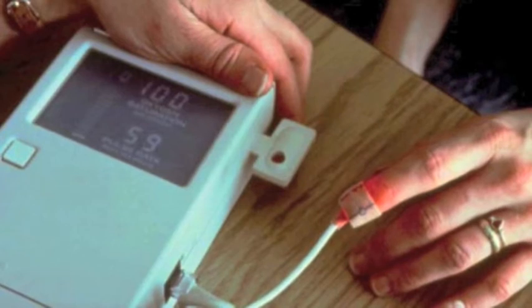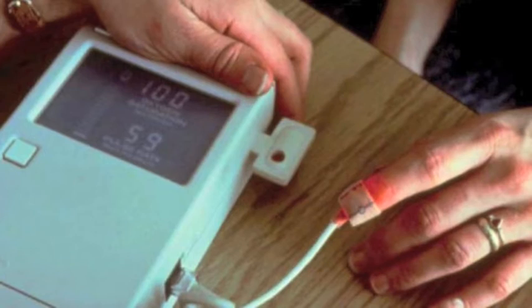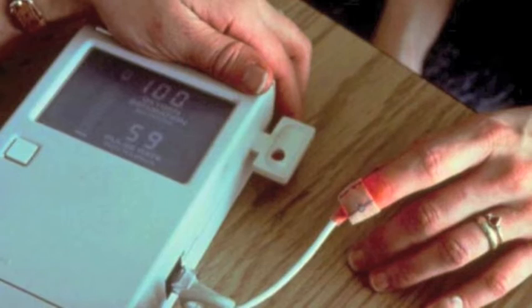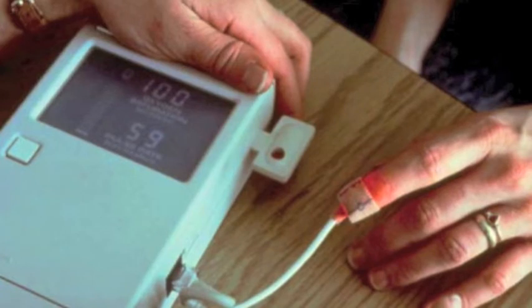It is often used for patients during an operation, when they are under anesthetic. It can also be used to determine whether a person has a disease that affects the blood. Some pulse oximeters display waveforms of your pulse. Some emit a sound if the pulse rate is too high or too low. Oximeters are also able to detect when a patient has too little oxygen before they show any visible sign, such as the lips turning blue.